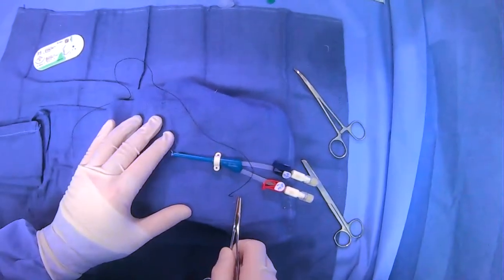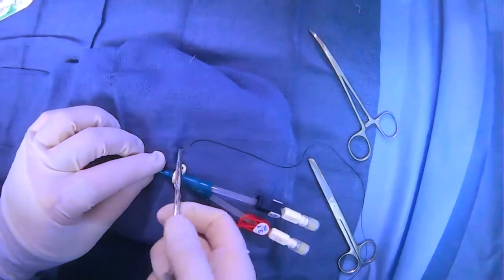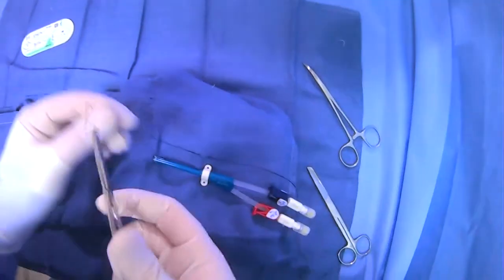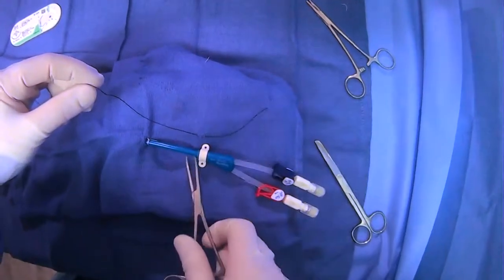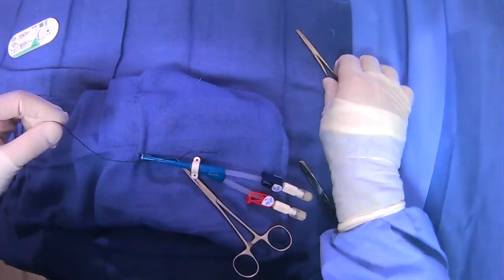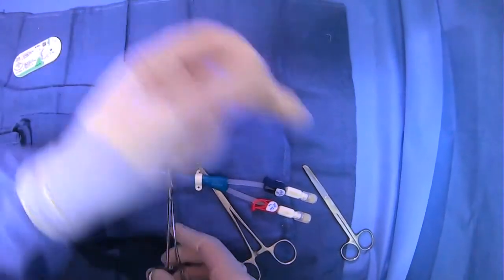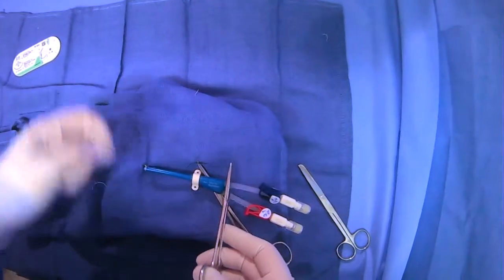We'll grab our needle, orient ourselves, and we're going to do two air knots — one here in this general location. What's helpful is you can clamp your suture with the clamp, and this will make it easier to make an air knot. I'm just going to instrument tie to save suture, and just make a little air knot there.